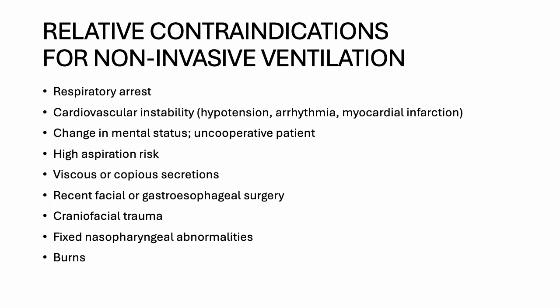Okay, some of the relative contraindications for non-invasive ventilation. No need to memorize. This is just for your reference. I need to show this because in some settings the physiotherapists are the ones that initiate and manage non-invasive ventilation. Not so much in Singapore, but a lot more in Europe and Australia. So we feel that we need to include this in the curriculum to make our curriculum more diverse.